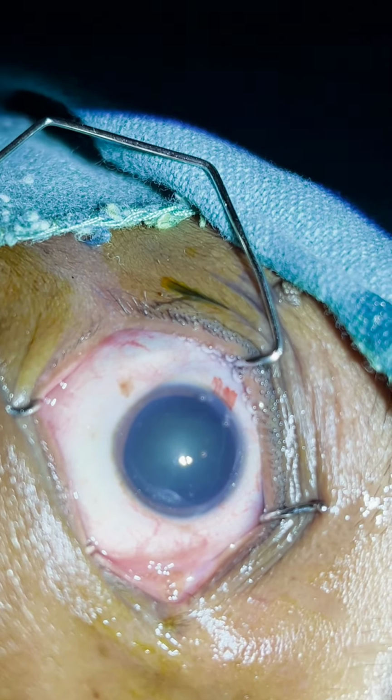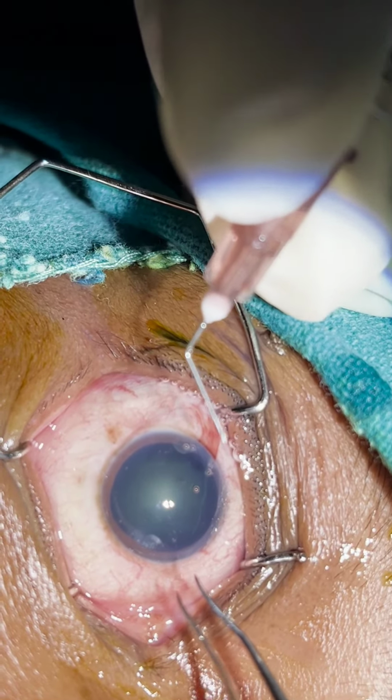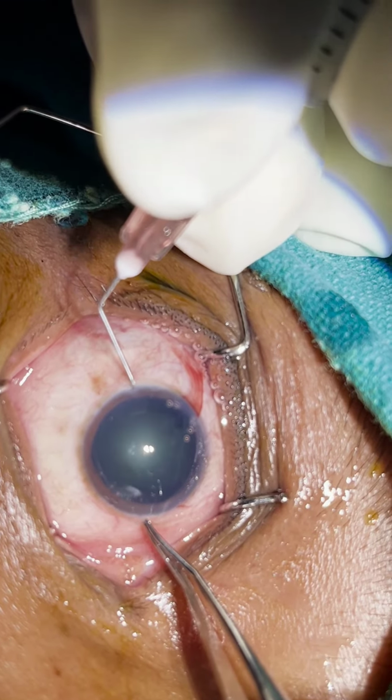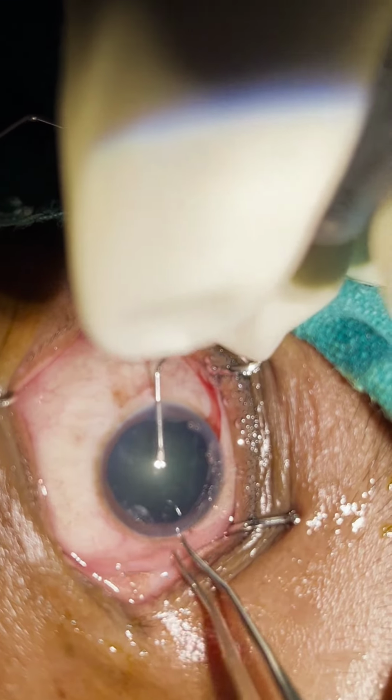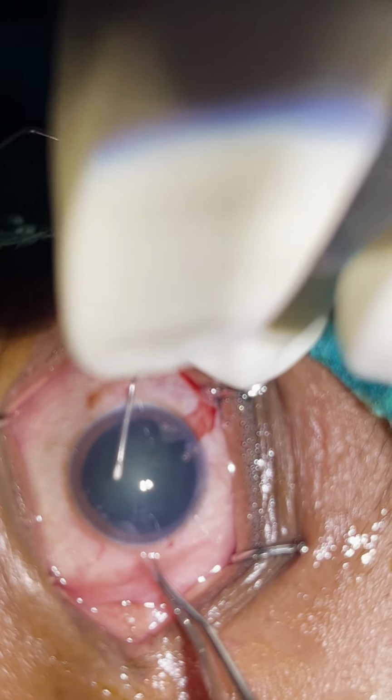Now we'll proceed with the rhexis. Usually I do a rhexis of 5 to 5.5 mm in case of phaco, and we can go with a little bigger rhexis if we do SICS cases.